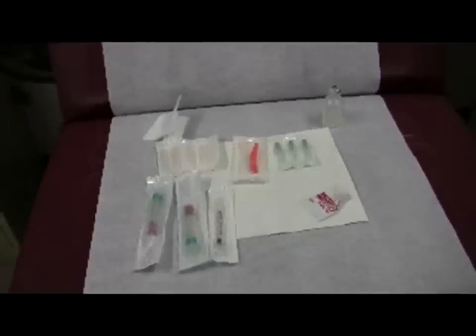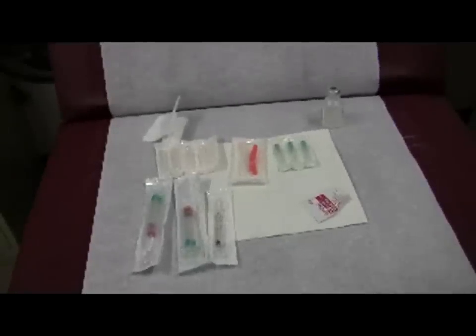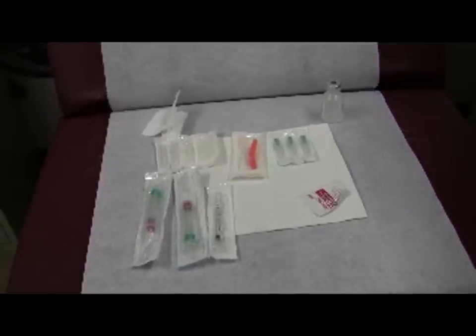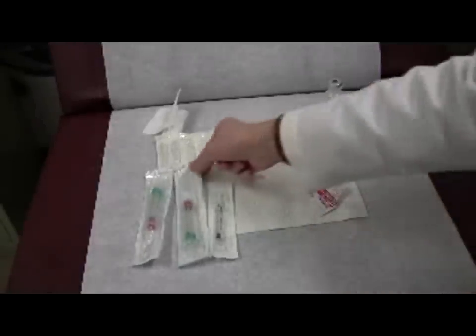Today we're going to be dealing with learning how to deal with a needle and a syringe. Keep in mind, opening the needle and/or the syringe package need not be sterile for routine injection.